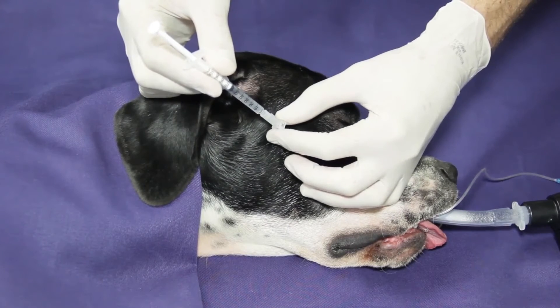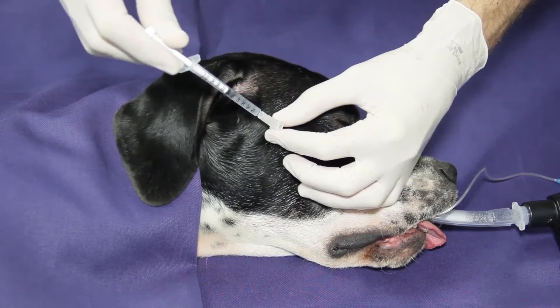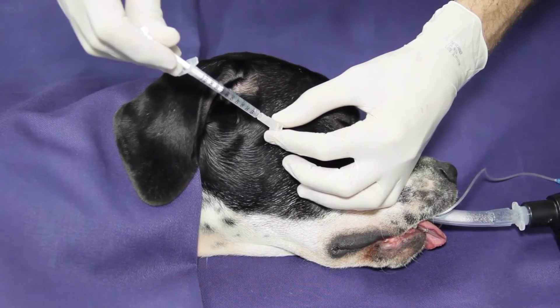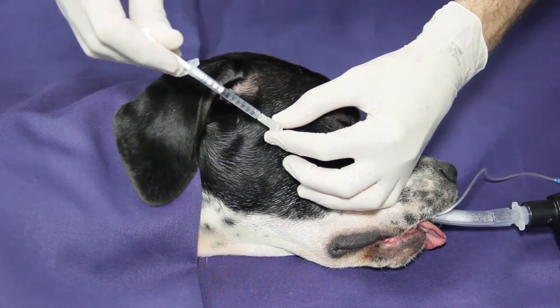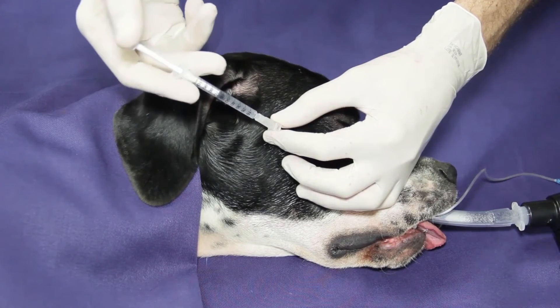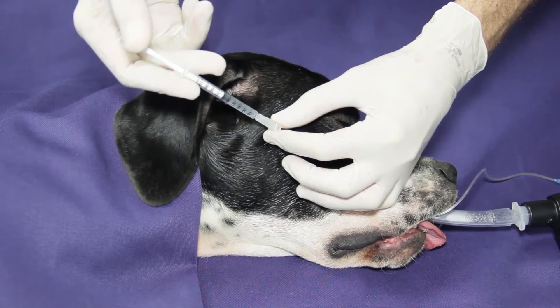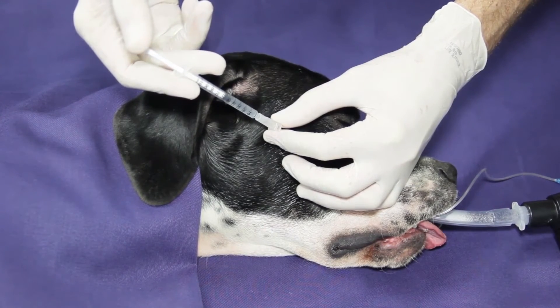The maxillary nerve block will produce anesthesia to the ipsilateral maxilla, including all the teeth, palate, and the skin of the nose, cheek, and upper lip.